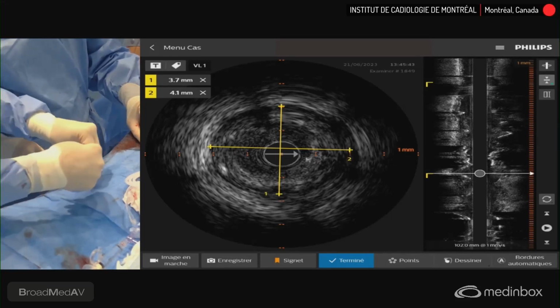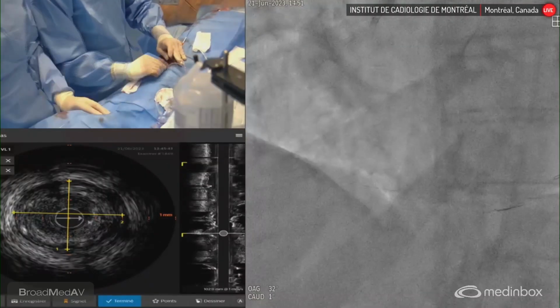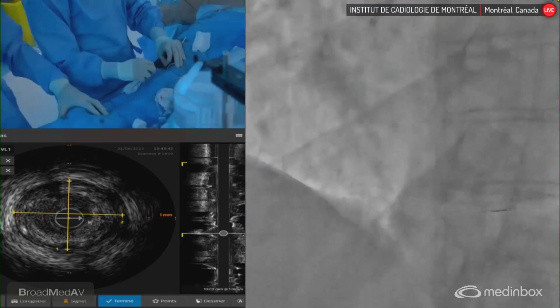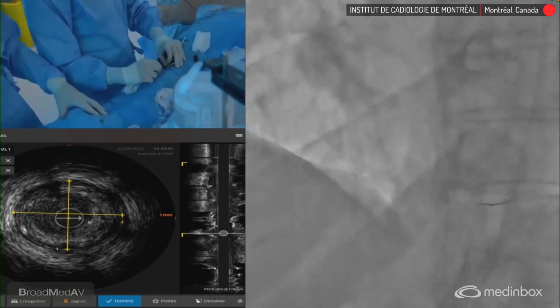So when there is limited disease, we typically use lumen and try to get 100% of the lumen as far as sizing is concerned. If we have a diffusely diseased vessel, then of course we look at vessel and downsize the eventual stent.